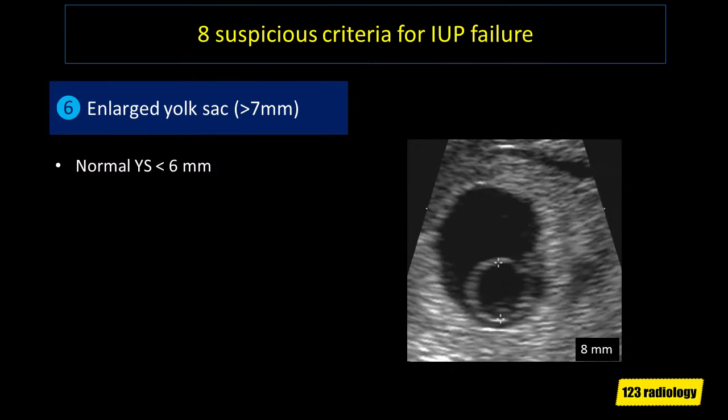The sixth suspicious criterion is an enlarged yolk sac greater than 7 mm. The normal yolk sac is less than 6 mm. If the yolk sac is 7 mm or more, that is suspicious for pregnancy failure. As you can see on this image, the yolk sac measures about 8 mm — this is abnormally enlarged and suspicious for pregnancy failure. Follow-up ultrasound study is recommended.